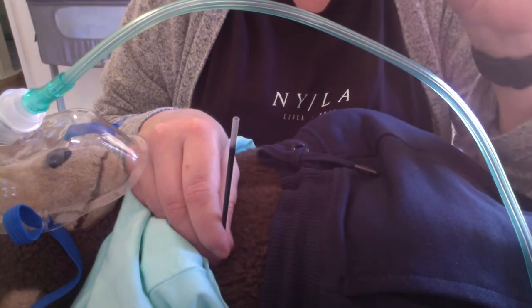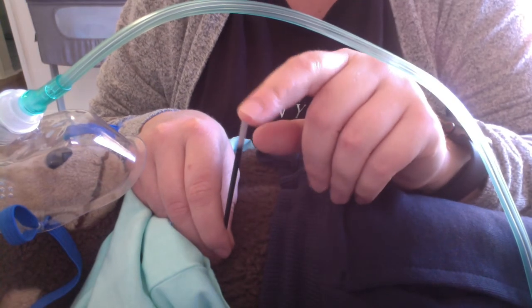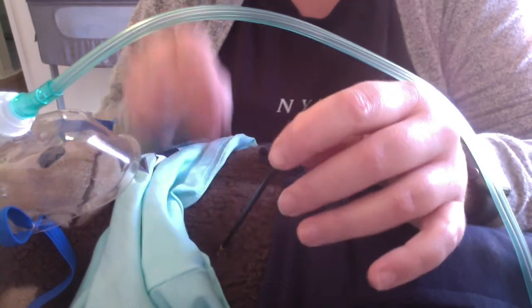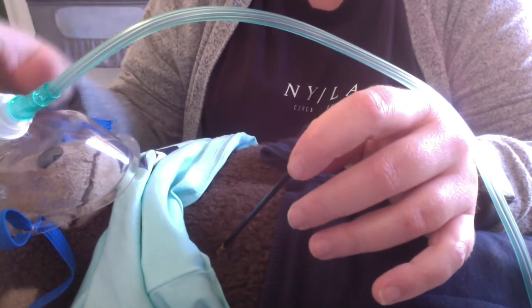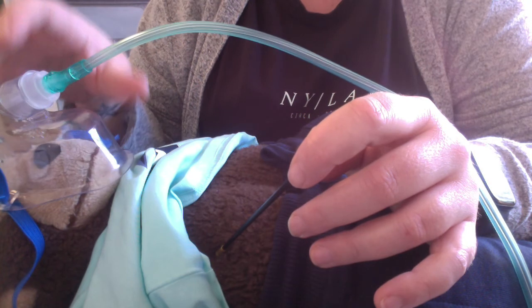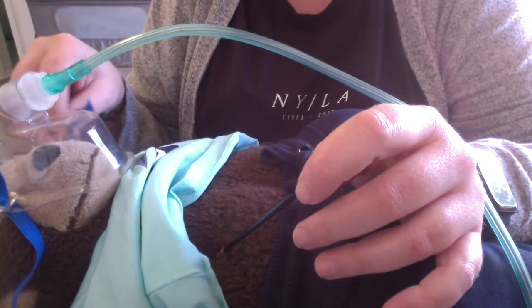You then attach your one-way valve to the cannula, securing it in place with tape, and then obviously monitoring the patient consistently for other signs of a repeat pneumothorax, which will then have to do another needle decompression.